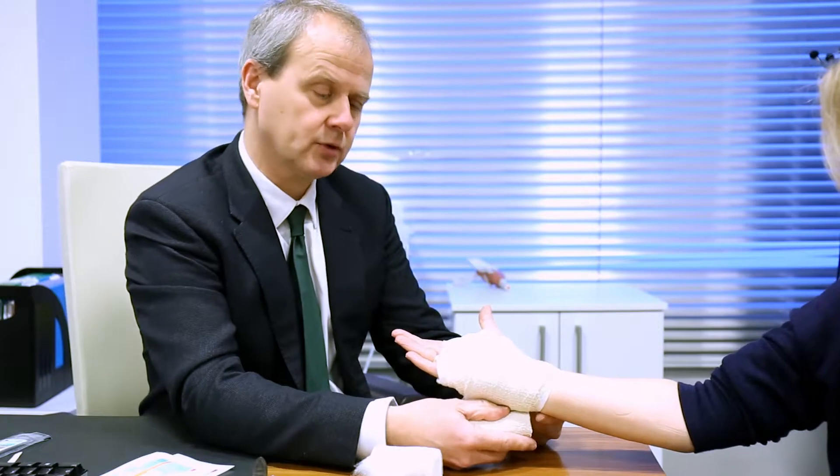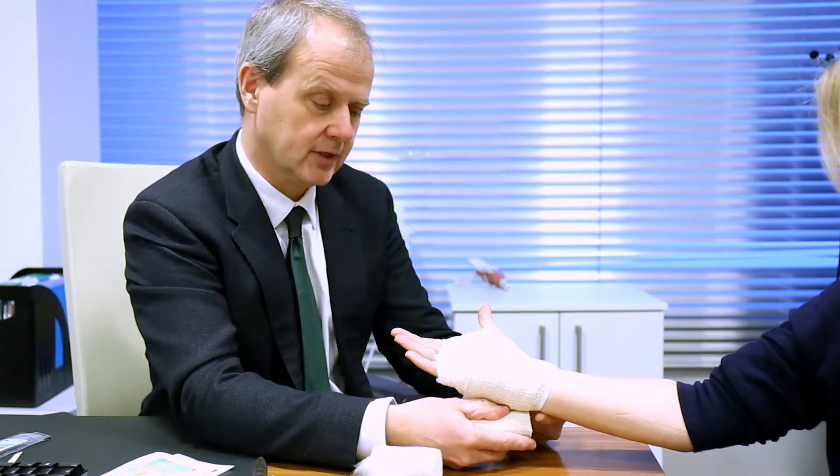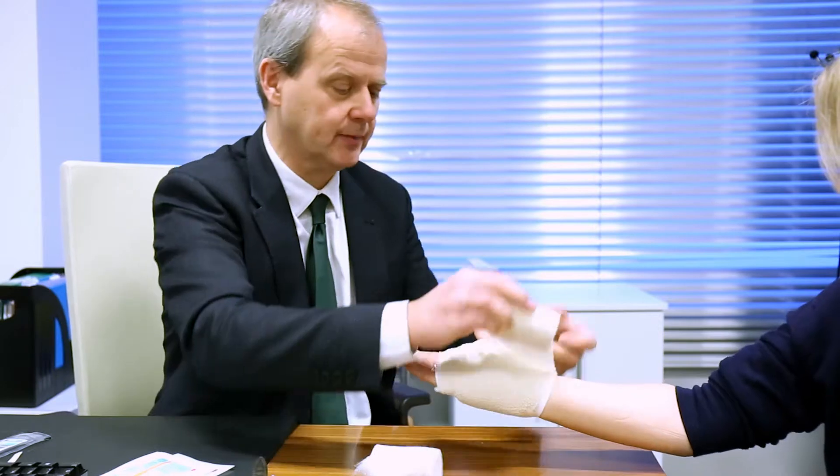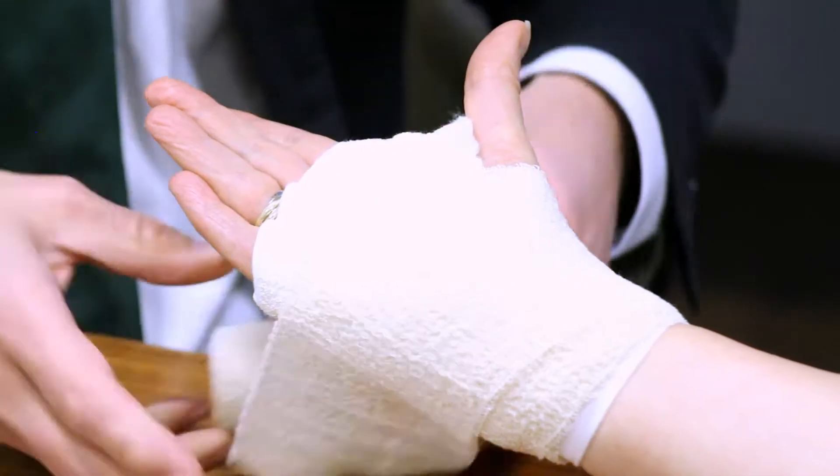And at the end of the operation, that's what your hand would look like at the end of a carpal tunnel, for example. I'm going to advise you to reduce the dressings. We simply have to do everything else in reverse. We just take everything off.